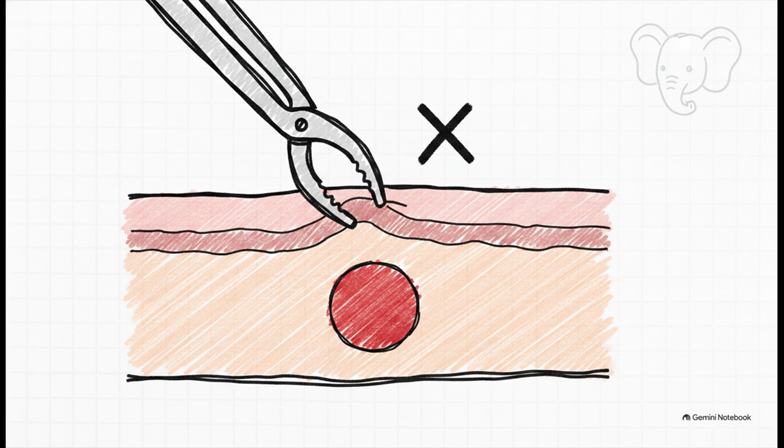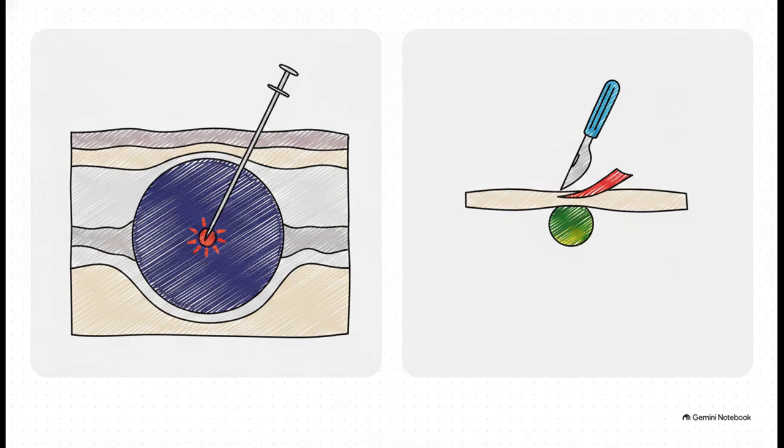And why is that? Because the forceps are just grabbing that superficial, healthy mucosa, completely missing the subepithelial layer where the actual tumor is hiding. Even bite-on-bite techniques usually fall short and just end up increasing bleeding risks. We need the right tools to dig deeper. And that's where choosing the right advanced technique comes in.